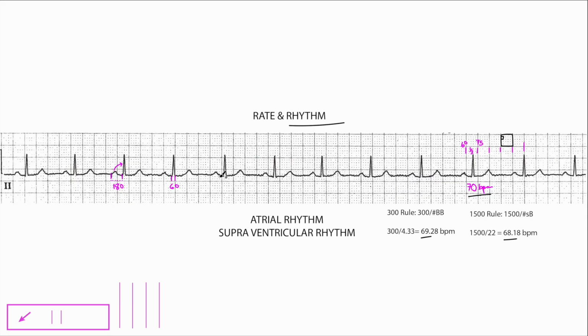And one of the things I really like to do is take a look at patients' old files. So if I have the time to do it, I will always pull the patient's previous ECG, if they were seen and have that on file. Sometimes they don't have that on file, and that's okay. You do the best you can.